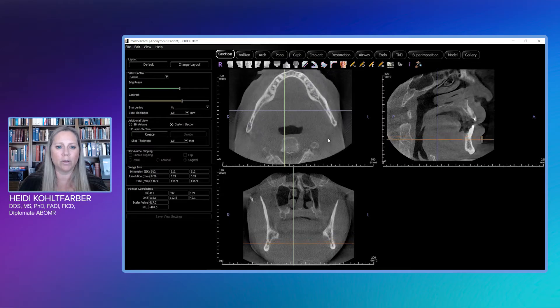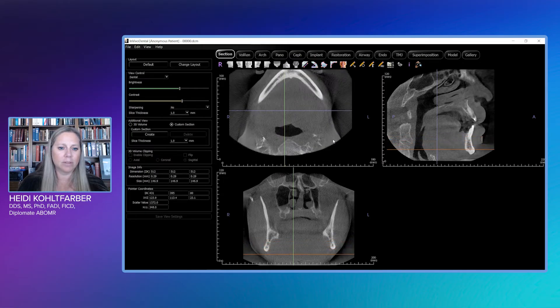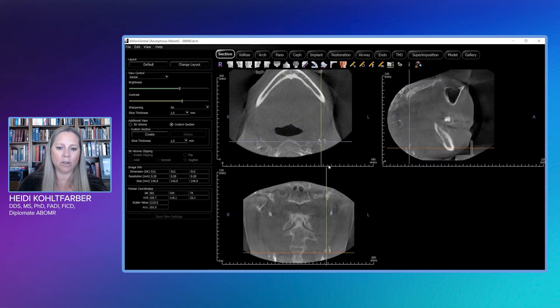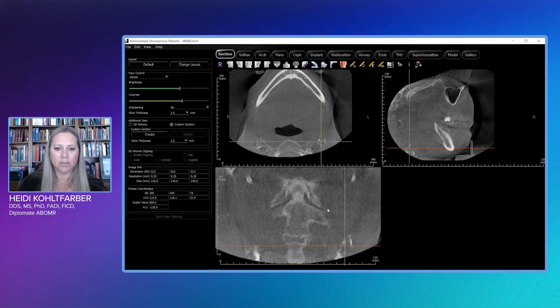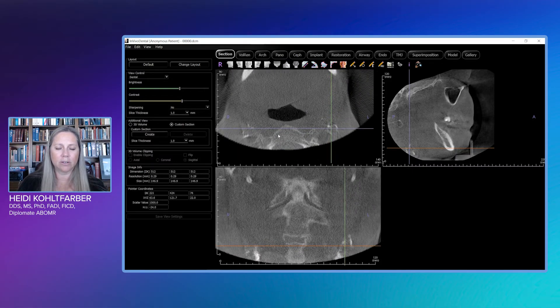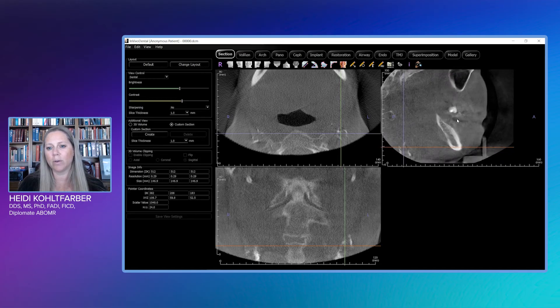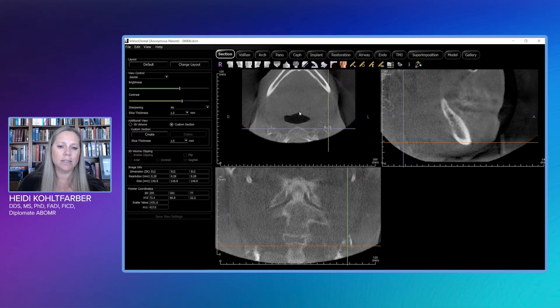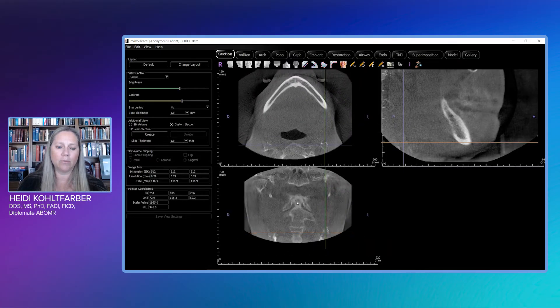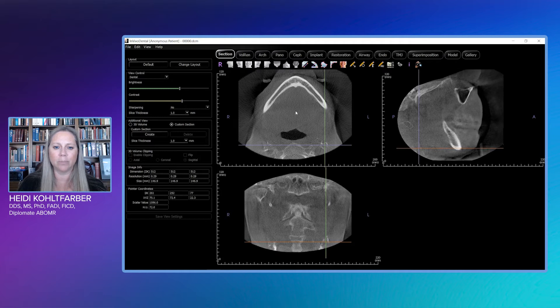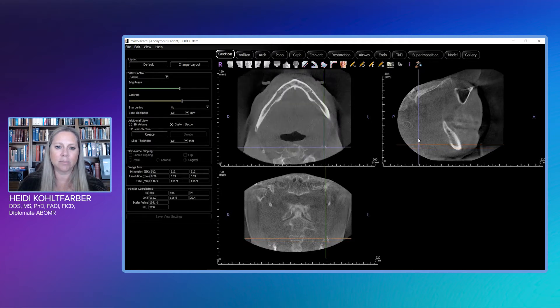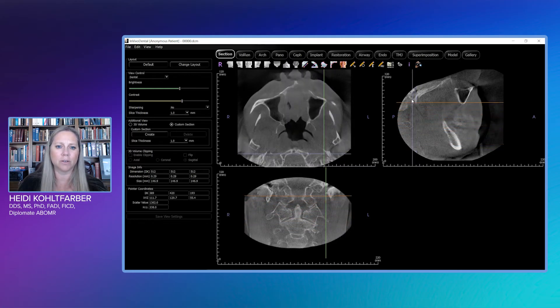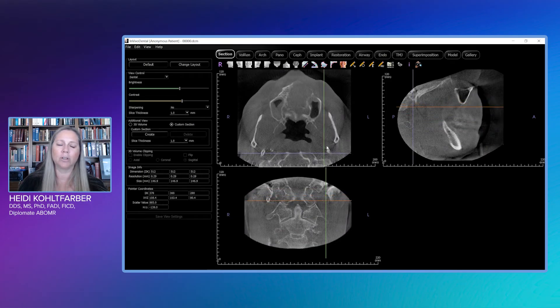Of lesser importance but still worth noting: we do have bilateral calcified carotid atheromas, posterior and lateral to the airway space, and it's fairly extensive. So he has several things going on. Looking at this overall, I'm thinking about a pattern of neglect — he's had kidney disease, so he's probably had a rough go of things.